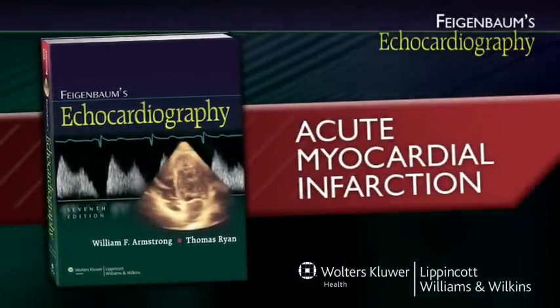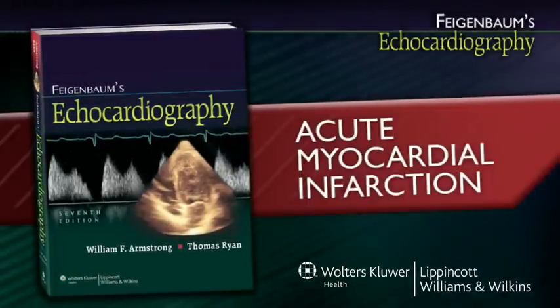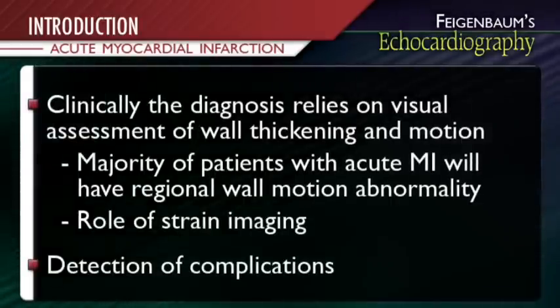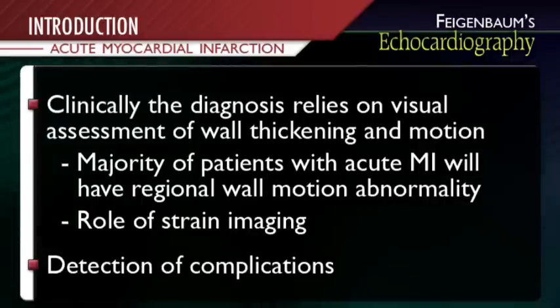Acute Myocardial Infarction from Feigenbaum's Echocardiography, 7th edition. Echocardiography plays a valuable clinical role in patients with known or suspected acute myocardial infarction.